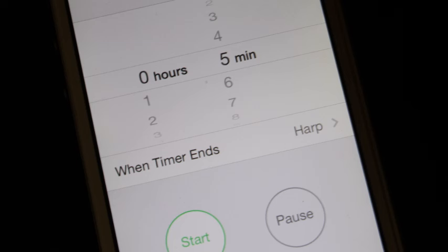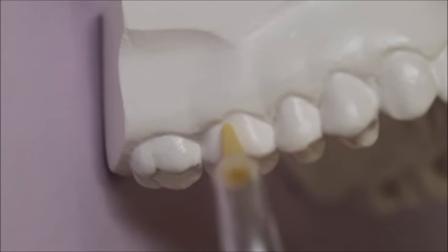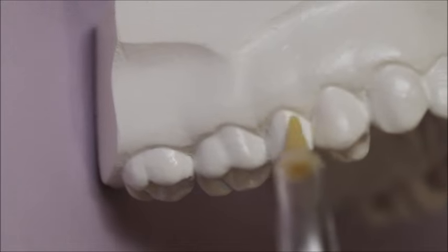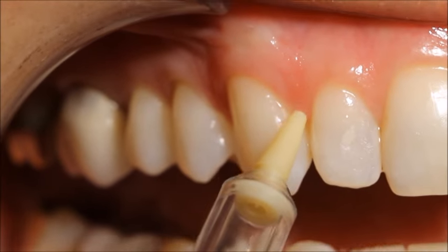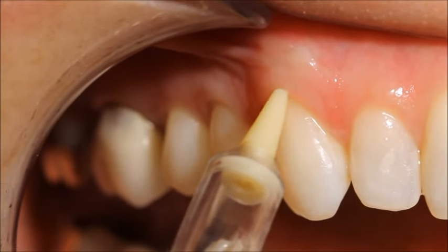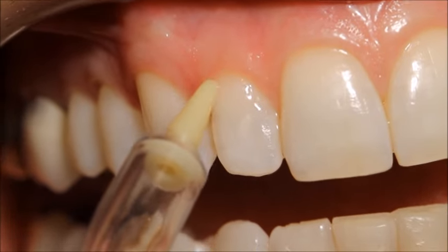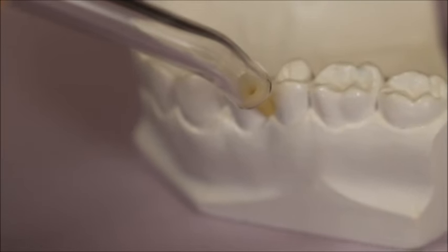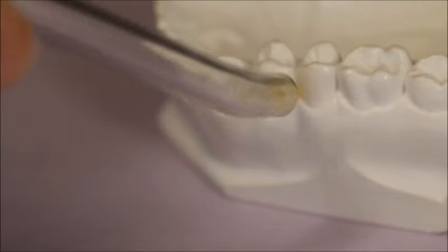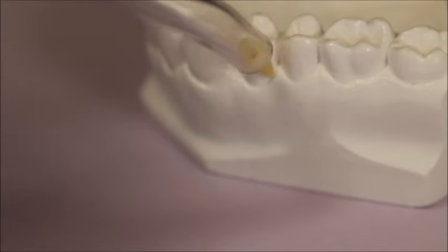Doing this correctly will take about 5 minutes to get through the whole mouth. We're going to demo on a model first without the water on. Like with a toothbrush, you're going to angle the tip at about a 45 degree angle towards the gums, tracing it very slowly along the gum line. You'll take about 2 or 3 seconds on each tooth, maybe going back and forth 1 or 2 times. In between the teeth, you can flatten the tip out more like 90 degrees and shoot the water jet between the teeth. Here you see it again on the model — very slowly along the gum line, pausing between the teeth and shooting the water jet through, creating a vortex that dislodges the bacterial film between the teeth.